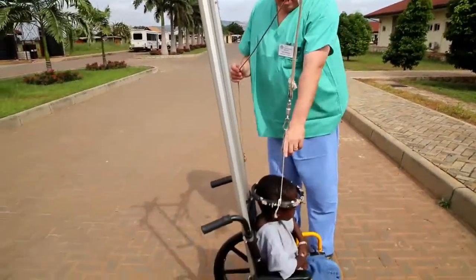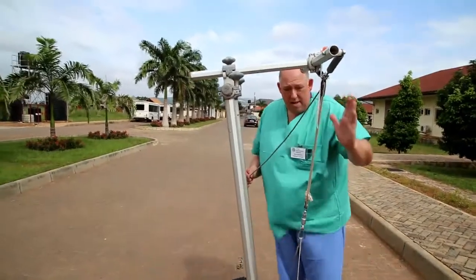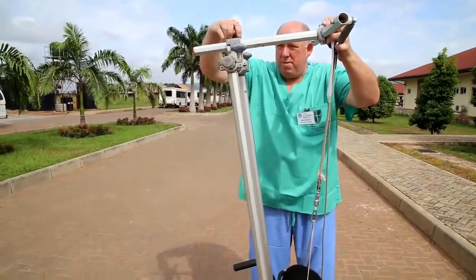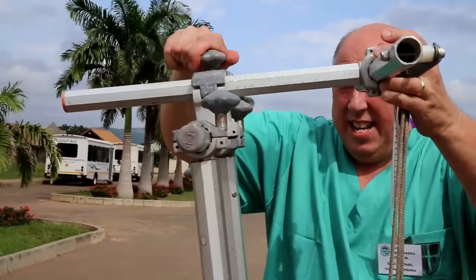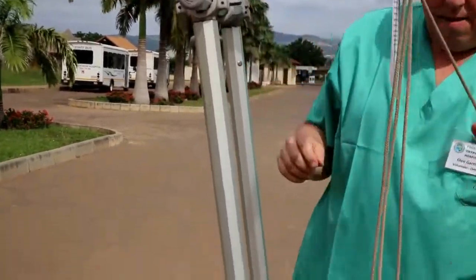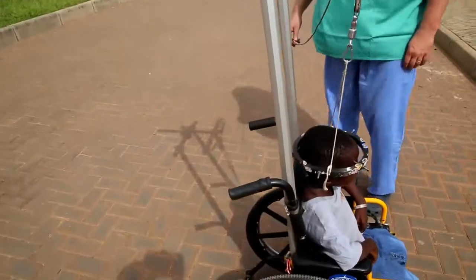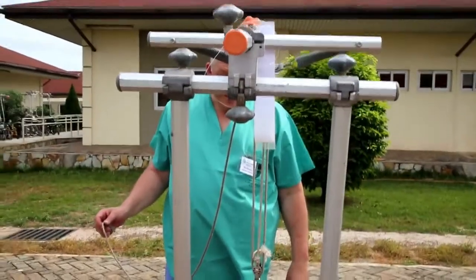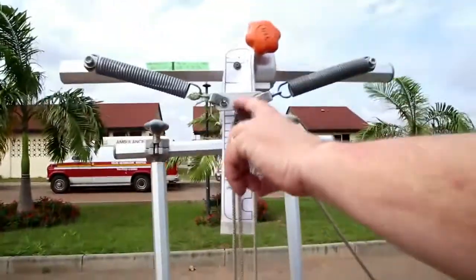In this case, the patient is sitting far back in the chair and we want him to sit more forward. We can align the system anterior-posteriorly — front to back — to be over the patient's head. We take the pressure off the traction system, slide it back over his head, and then reapply ten pounds of traction. Now it is centered and pulling him directly up. Side to side, the alignment looks good — centered over the patient's head and over the chair. The traction weight on the system is ten pounds.